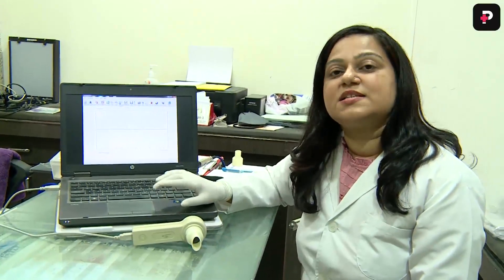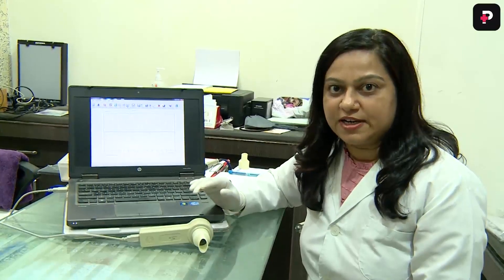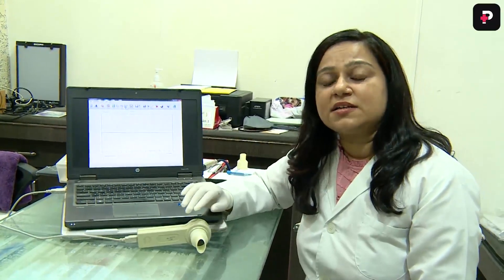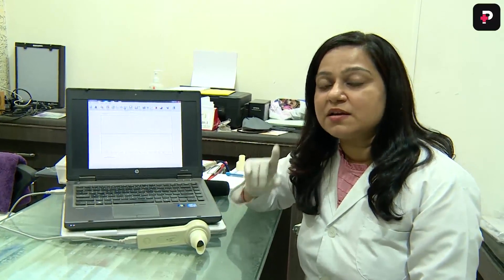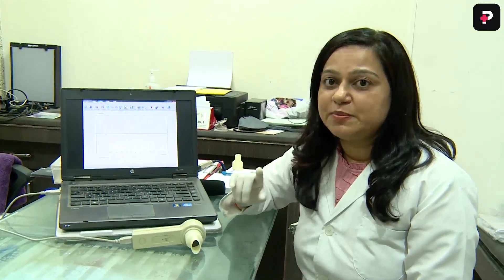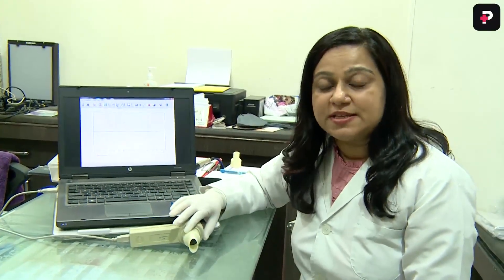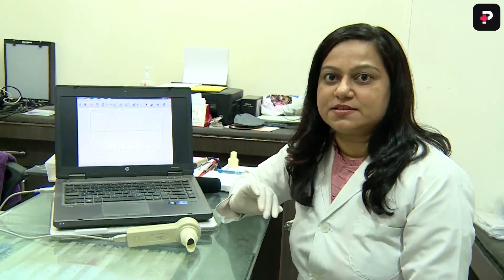The next test is the maximum voluntary ventilation test. In that, you have to ask the subject to inspire and expire deeply through the mouthpiece for 15 seconds.